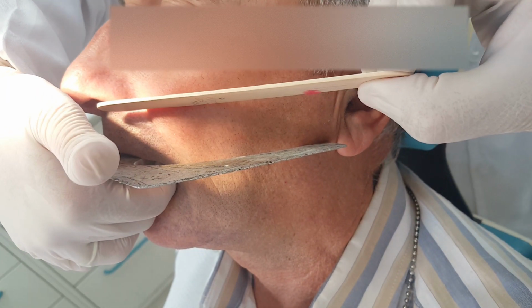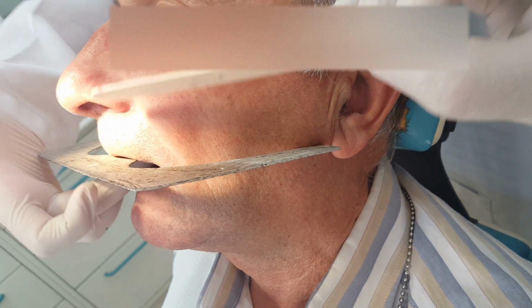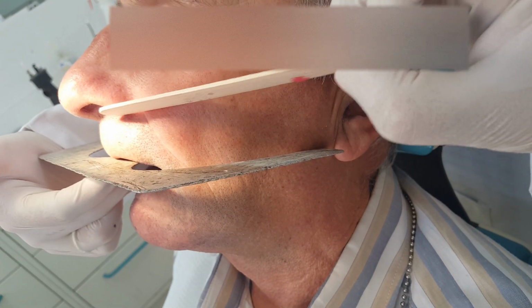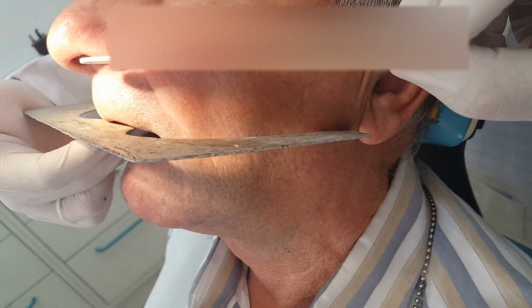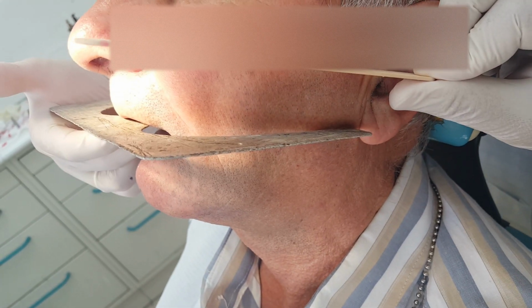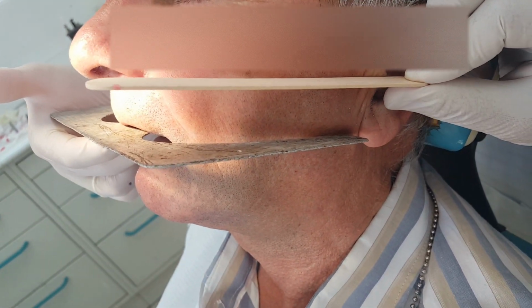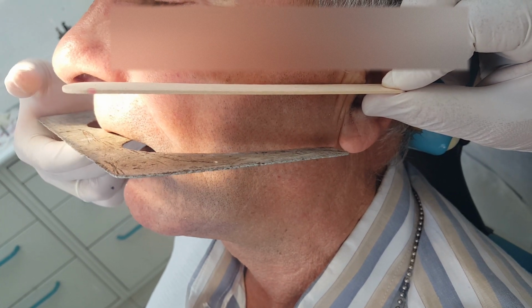But we usually, for extraoral examination, not radiographic examination, we're talking about extraoral examination. We prefer this point because it's more definable by the student. So if you're going to use the lower ala, we're going to use middle or lower of the tragus. So this is the tragus. I put this and then I lower this and I see that we don't have parallelism yet. You're going to add posteriorly.